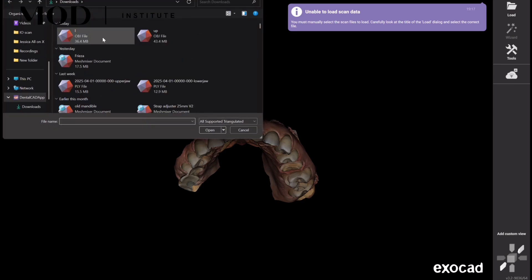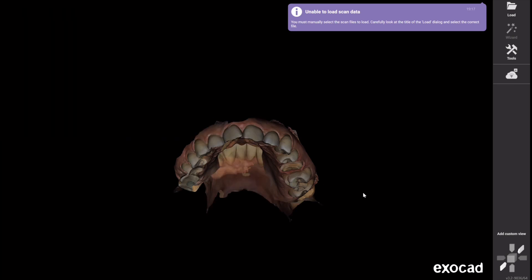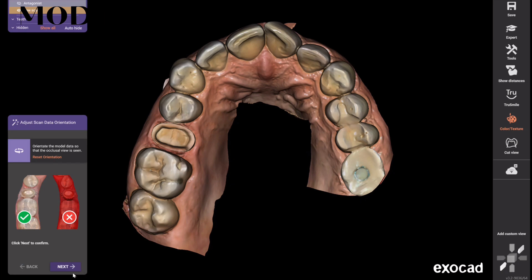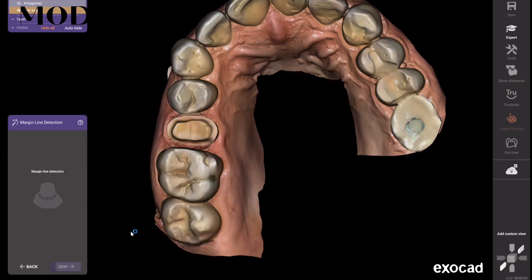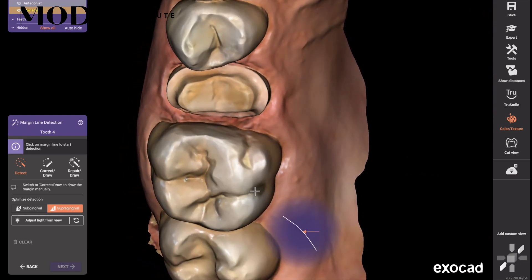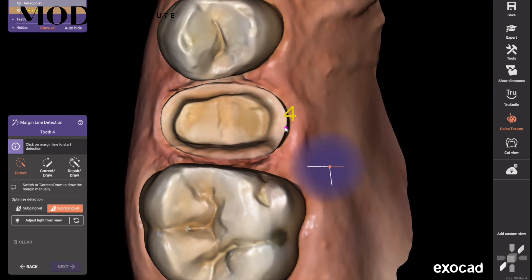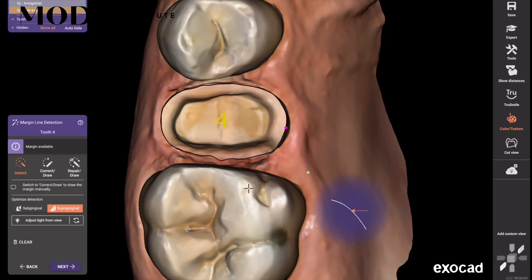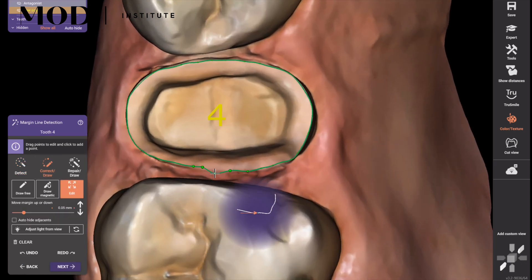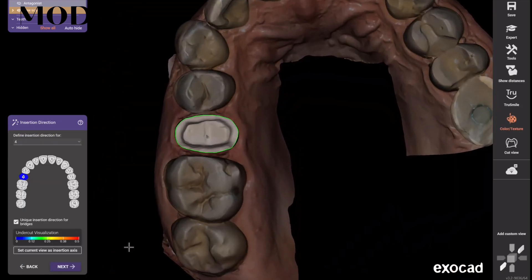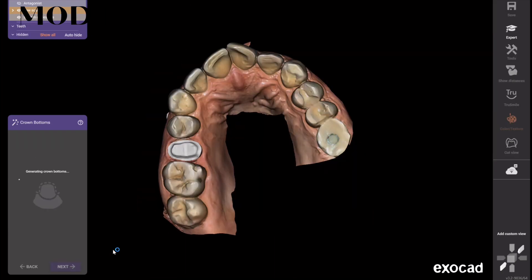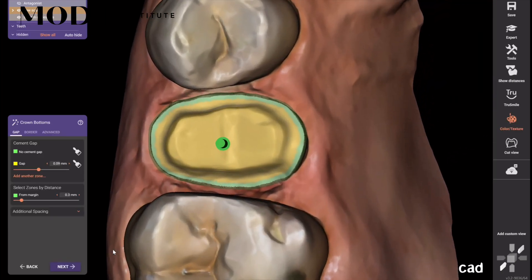Let's go ahead and load this case she sent me that she was just struggling hard with — this poor girl must have milled like 25 restorations trying to get this to work. First, pick your orientation, which you should be looking straight down on the tooth. I'm going to skip the AI just to show you how fast this could be. For margination, click somewhere that's crisp and distinct, then go to correct draw and just tweak the lasso line if you need to. Her doctor has skills — that's a really good overlay crown preparation — so it's definitely not the prep.